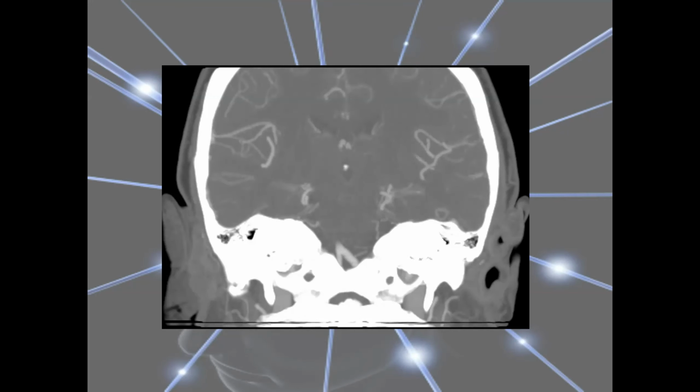Is this one C2? Perfect. Perfect. And it's actually blood windows. Okay, so it's not bone windows. It's not soft tissue windows. It's blood windows to see the opacified blood vessels.